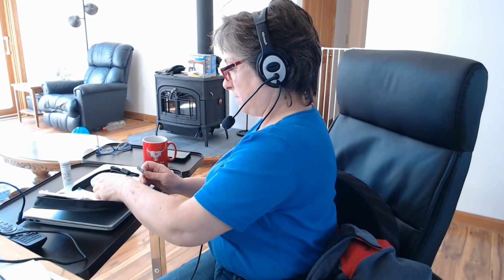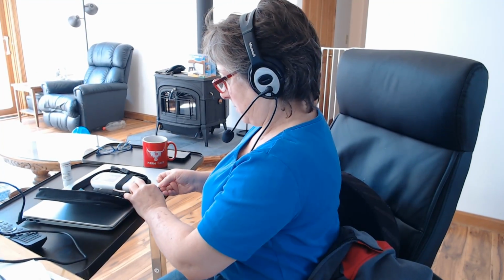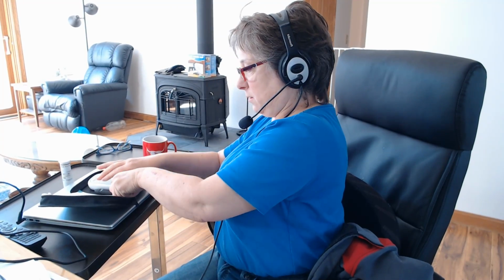So this is a test strip. Before I put the test strip in here, I'm just going to stage it here. I have to do this every 2 weeks, and I do this at home. The good news is I can do this at home. The bad news is that since I live in the United States, I can only rent or lease these. It's on a subscription.